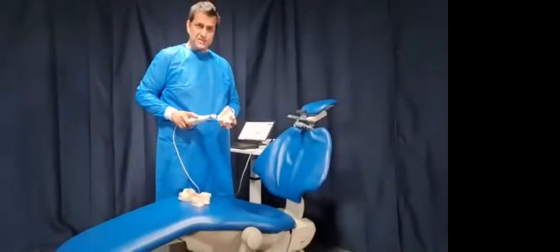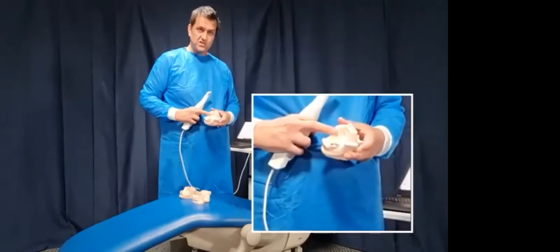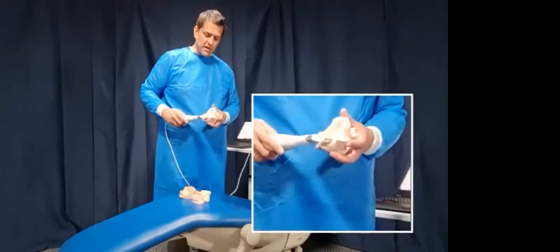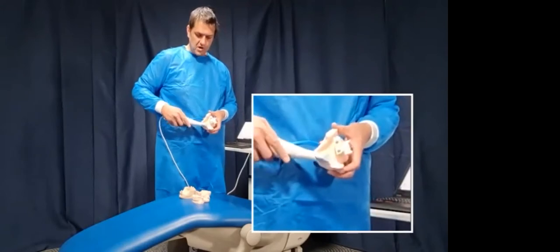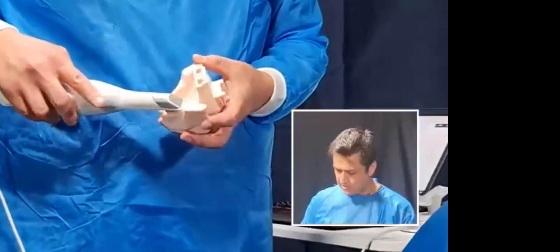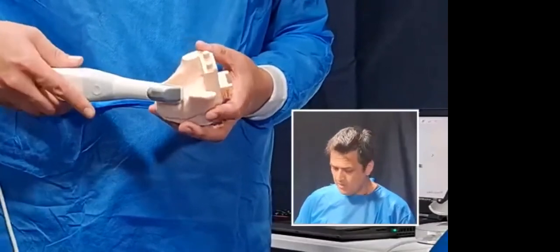I basically always start where the most amount of teeth are, no matter what. Typical scan strategies will tell you to stand on the left and make your way along the occlusal surfaces, but I wouldn't do that. On these cases, I always start where the vast majority of hard structures are, and I literally just roll over and around, rolling and rolling with my supporting index fingers and thumbs as I keep going. That would be how I would do it.